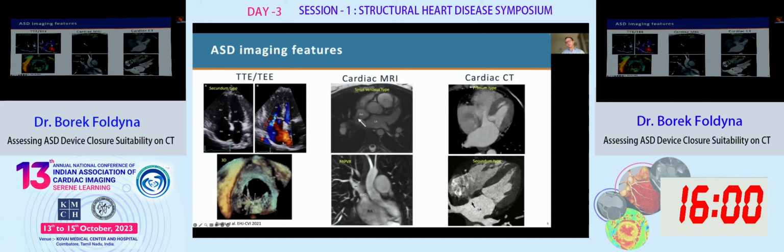These are real ASDs. If somebody's talking about a PFO, a patent foramen ovale, these look a little bit more like a channel. So we see actually the membrane over the ASD or over the connection, and these are not considered real ASDs.